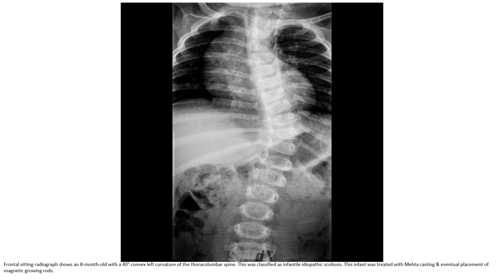Frontal sitting radiograph of an 8-month-old with a convex-left curvature of the thoracolumbar spine, classified as infantile idiopathic scoliosis. This patient was treated with Mehta casting and eventual placement of a magnetic growing rods.